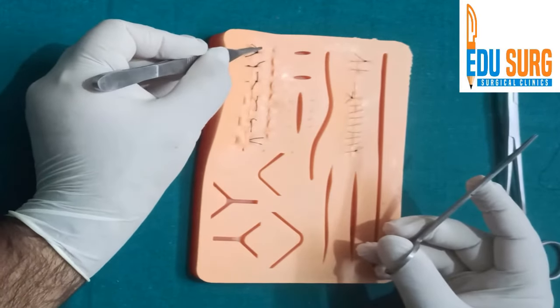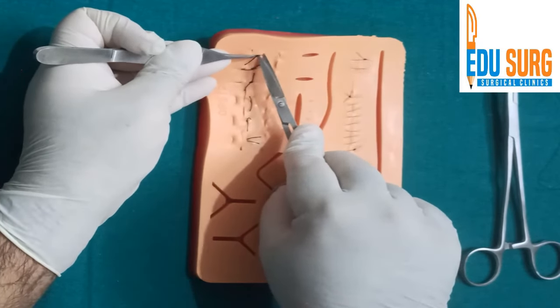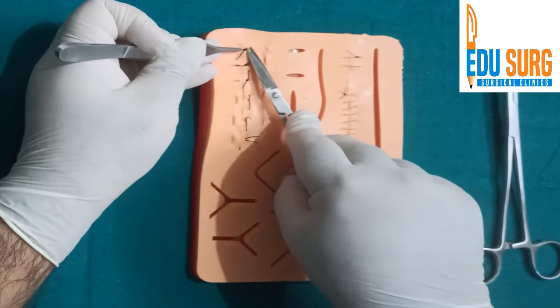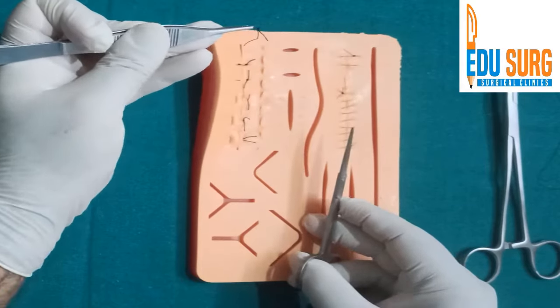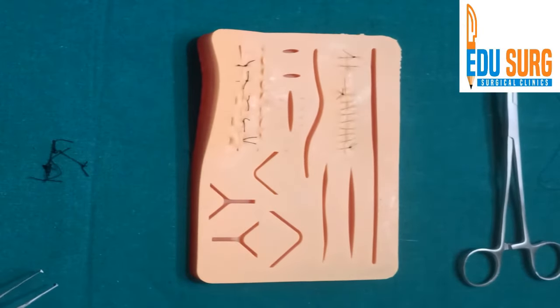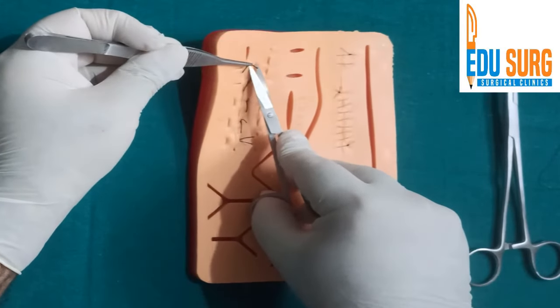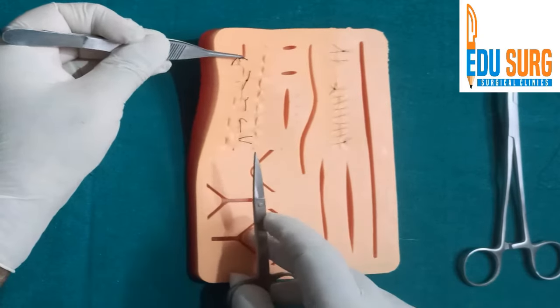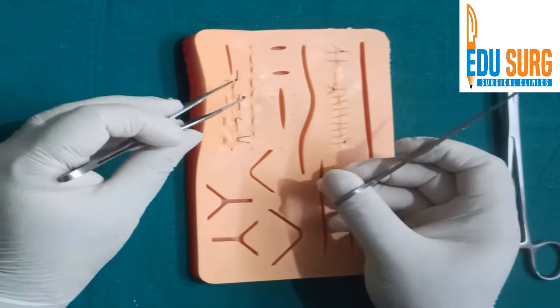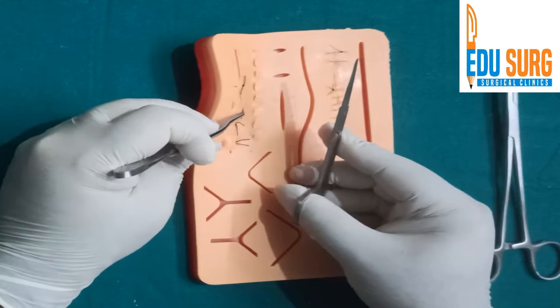The same principle applies to vertical mattress stitches. Pull, go a bit deep, and cut, then pull it out. Vertical mattress removal is a bit more painful than simple interrupted stitches.